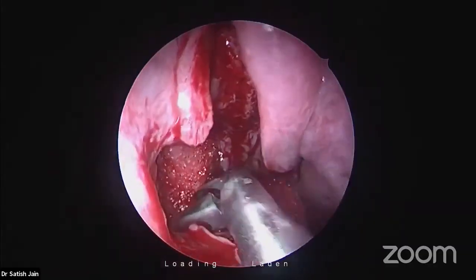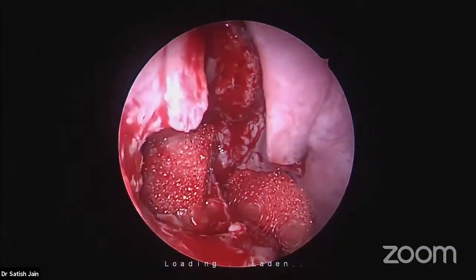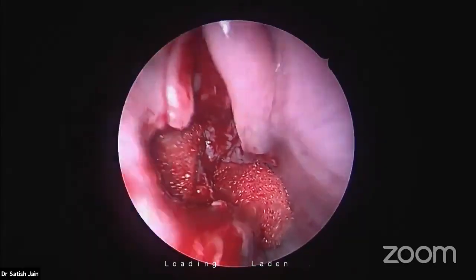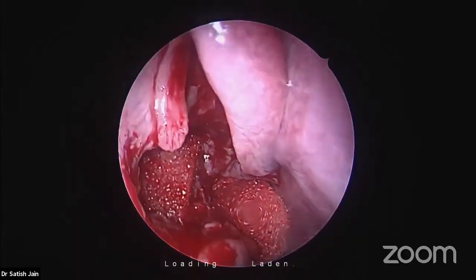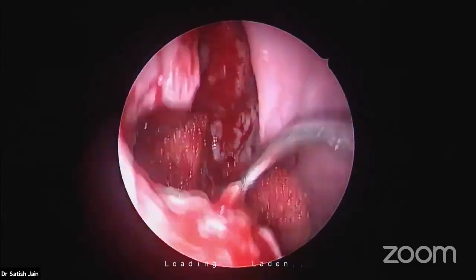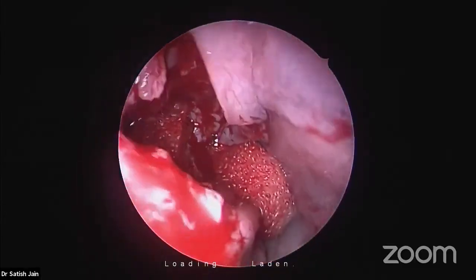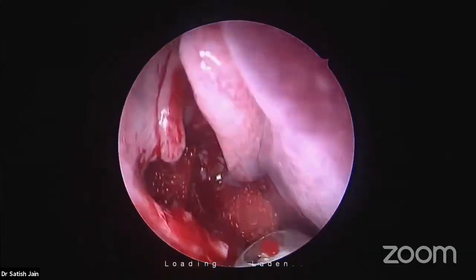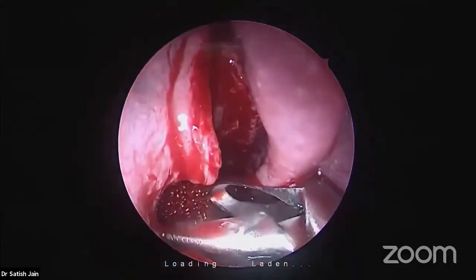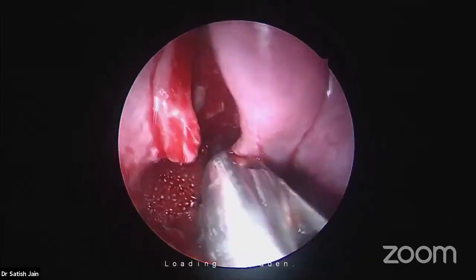One more question, sir. When you are approaching the maxillary sinus, please enlighten us how to approach anterolaterally and what are the possibilities to reach there. That's a great question. Again, I tell you, different instruments. To reach anterolaterally, first of all, you can use your 70-degree endoscope and your angled instrument, but sometimes it is not all that easy, and still it doesn't give that much access.